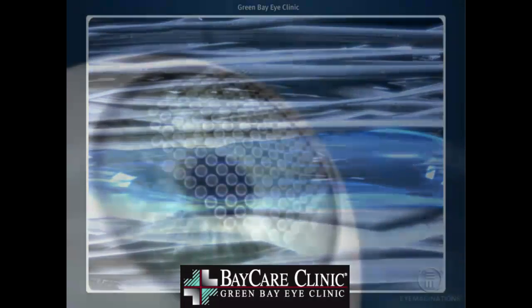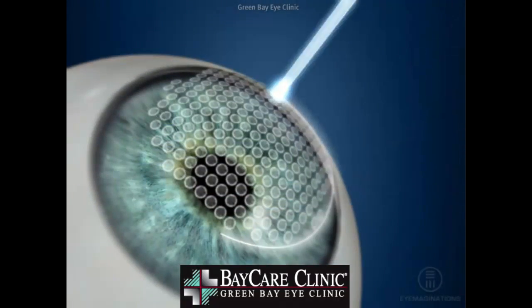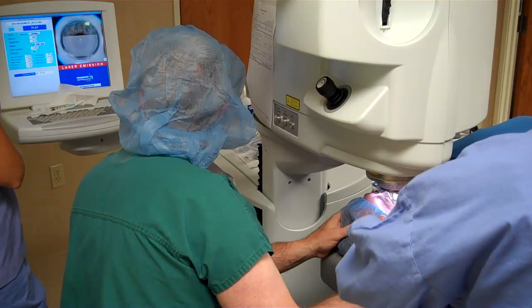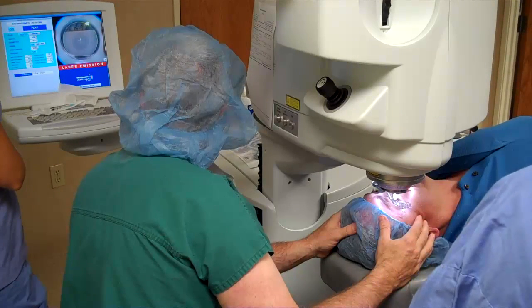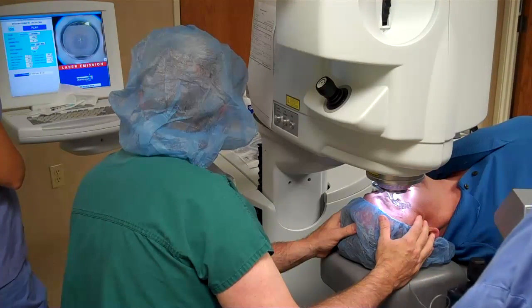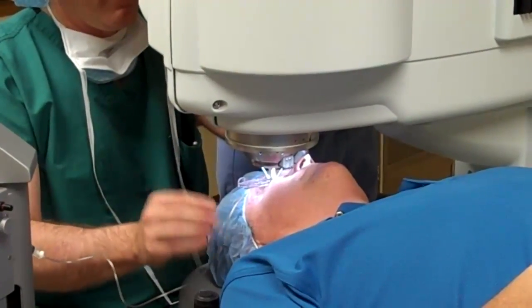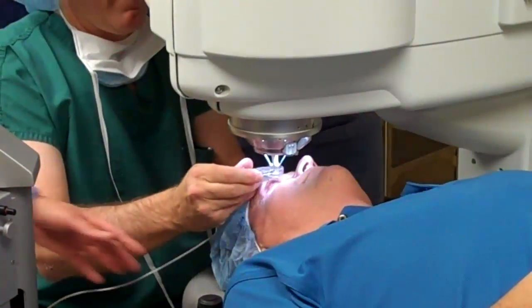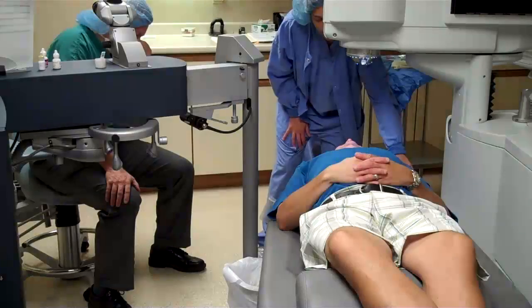These flaps are very thin. They generally measure only 100 microns in size. That's about 20% of the overall corneal thickness. But they are a very thin wafer of corneal tissue. They are left hinged along the top portion, so that when the surgery is performed, the flap is reflected and the actual laser treatment is then done.